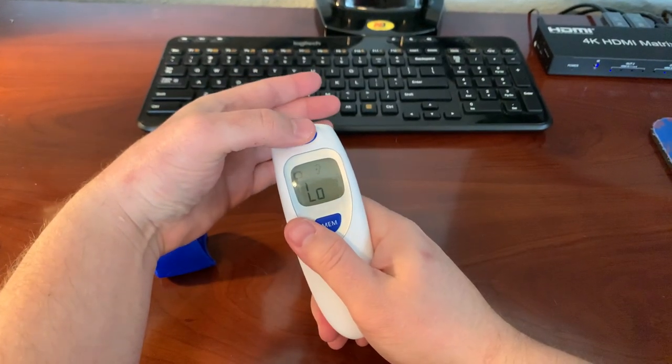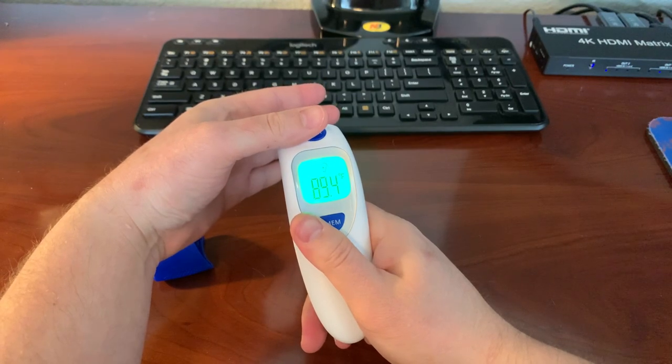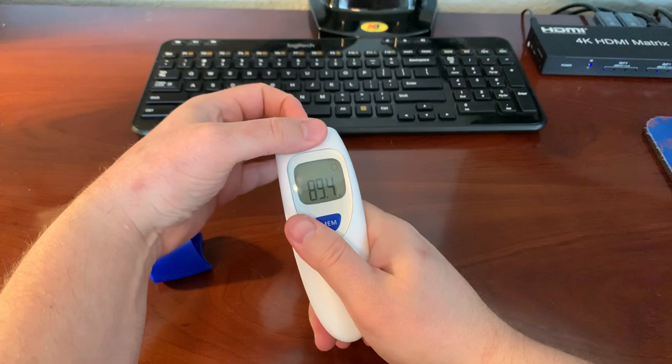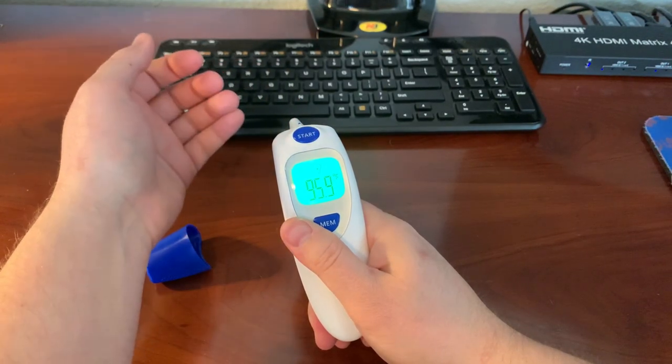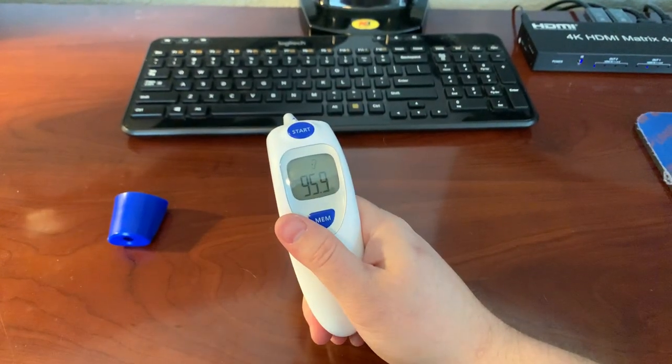The temperature difference between the two — I'll show you: 89.4 for one mode, and then with it depressed, 95.9. So it has some internal calibration between the two measurements, which is kind of cool.